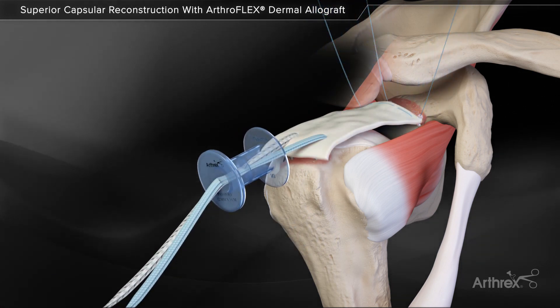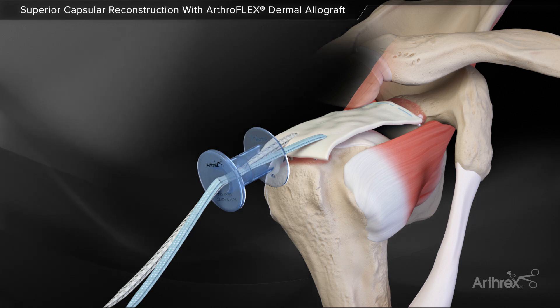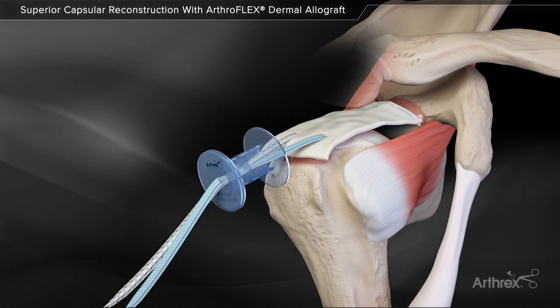With the graft in place, the three blue repair stitches are tensioned to their final fixation, compressing the graft to the glenoid bone.